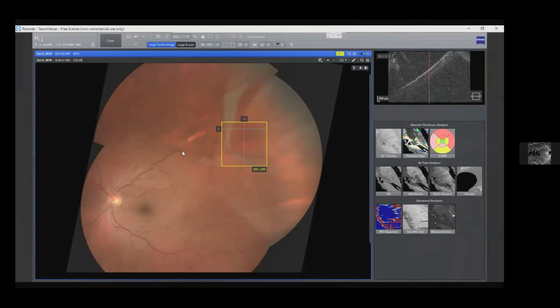But you want to confirm that finding. This is someone who maybe, if it's just an outer retinal break, you could observe very carefully or just laser this region. But if it's a true schisis detachment, the patient will probably need surgery because that's a fairly progressive issue. And so what we did was get a peripheral OCT.